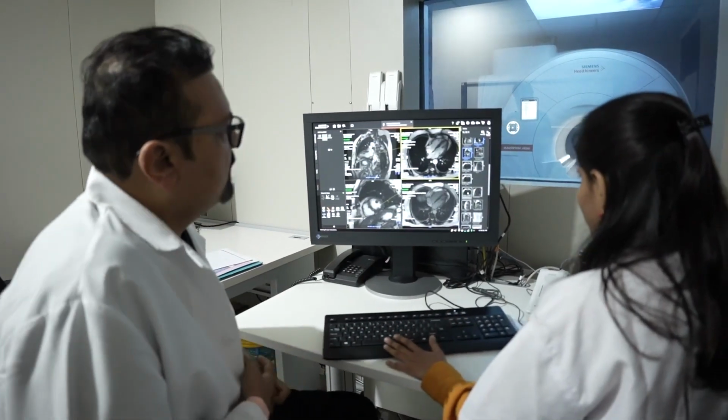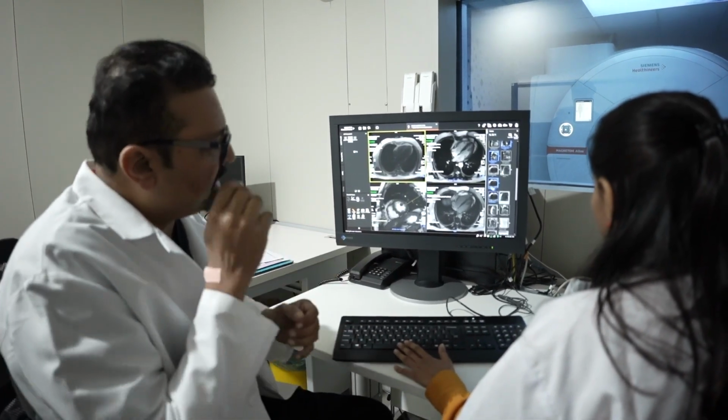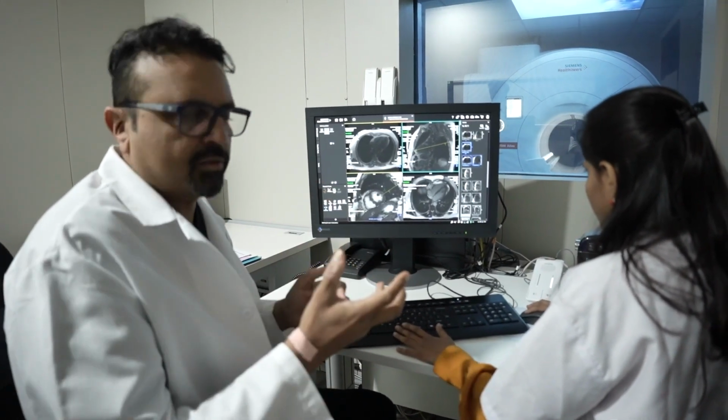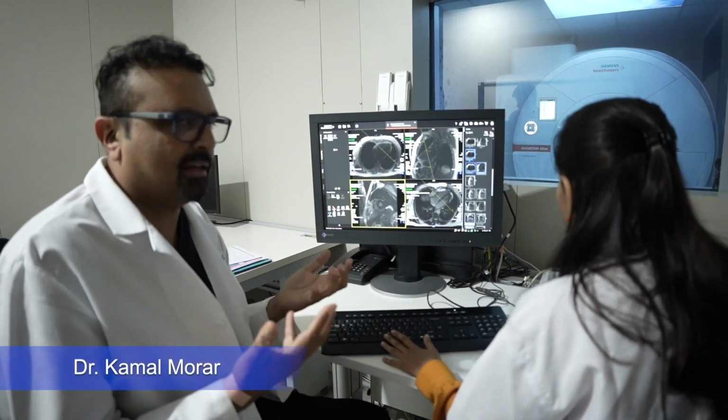The next part is we're looking to see the muscle, how much blood flow is actually being taken up by the muscle. So if you've got a blockage, in the CAT scan we see that maybe the artery has a blockage or something. Well, the next question is, is that significant? Is that really making a difference?